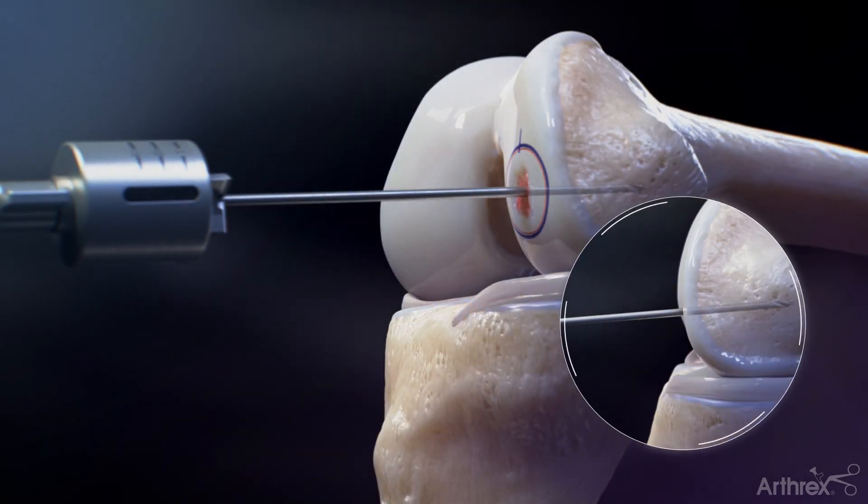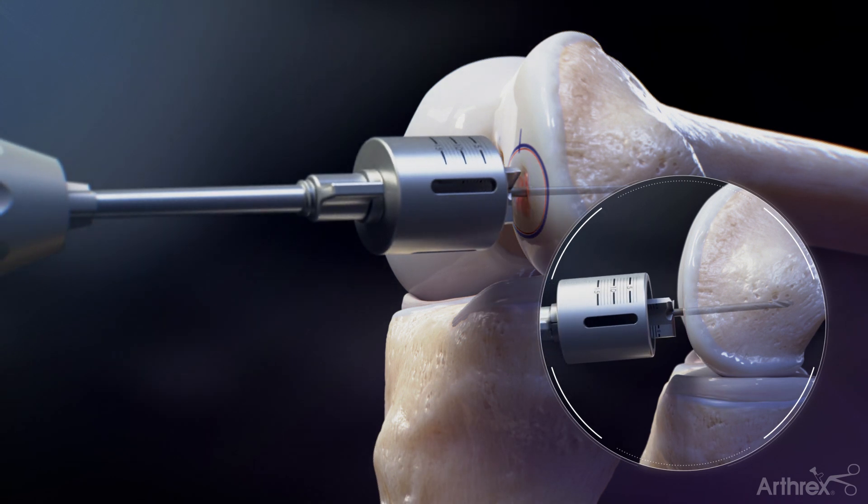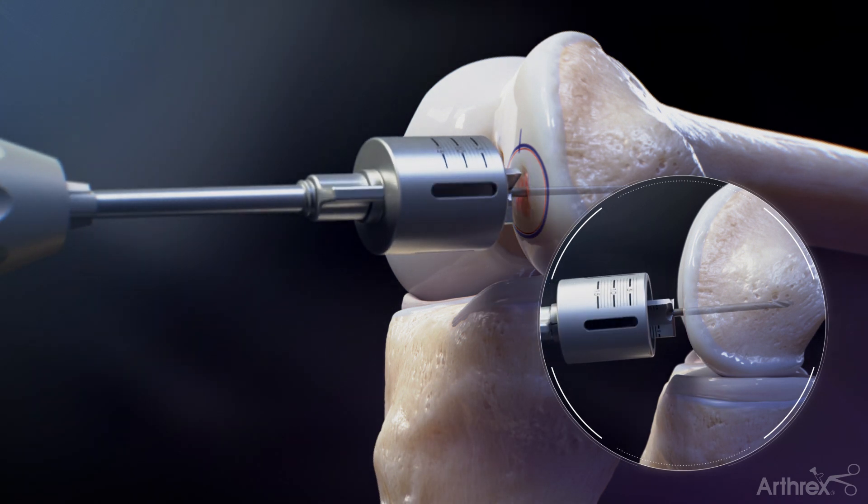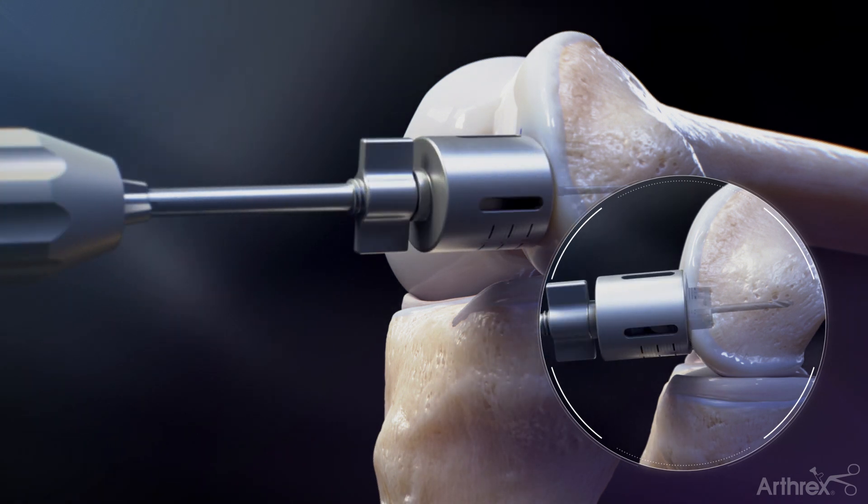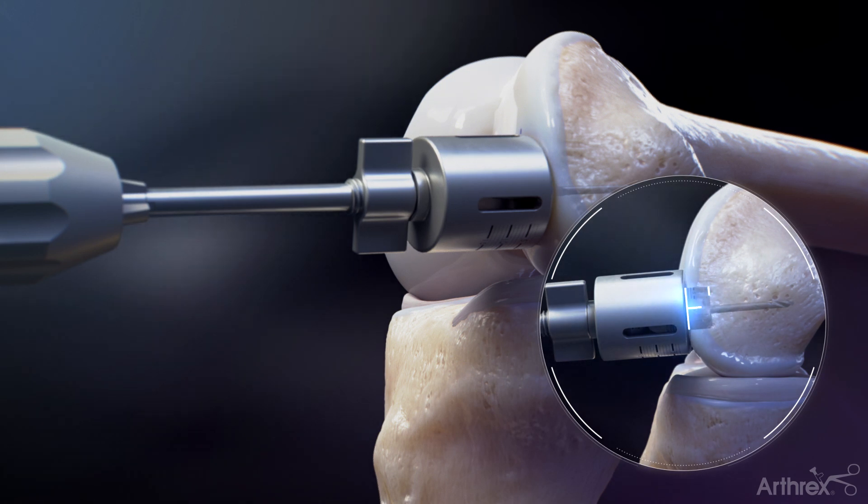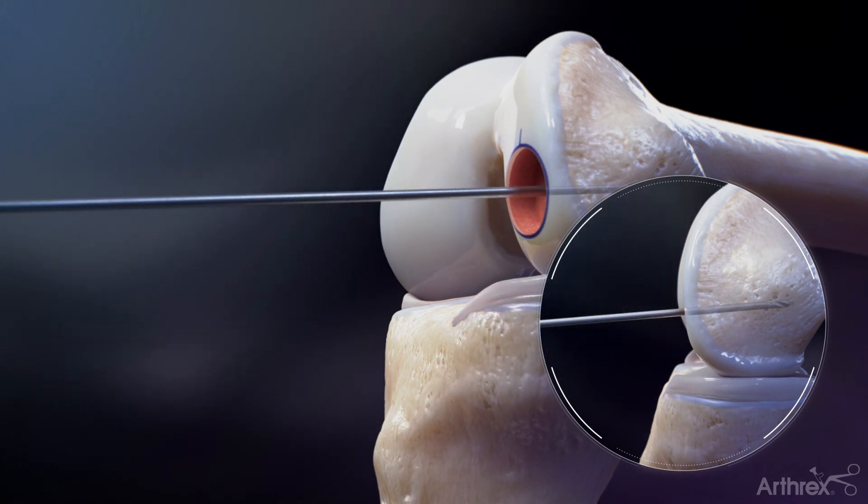Secure the recipient site reamer with depth stop to the drill and place it over the drill tip guide pin. Drill the counterbore into the defect to the desired depth, typically 5 to 8 mm. Confirm bleeding subchondral surfaces.